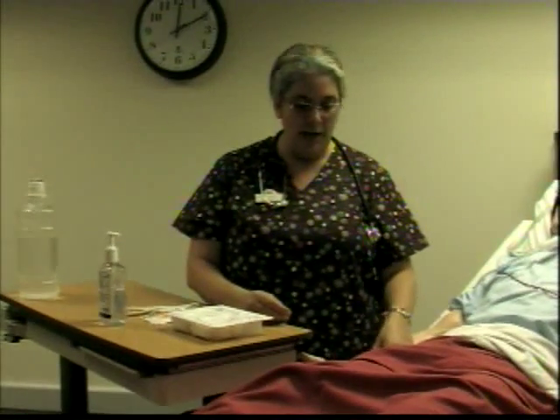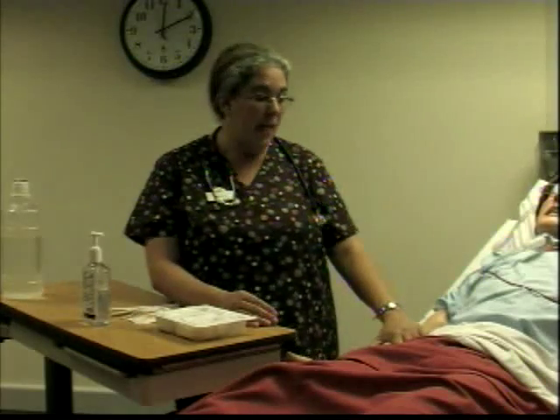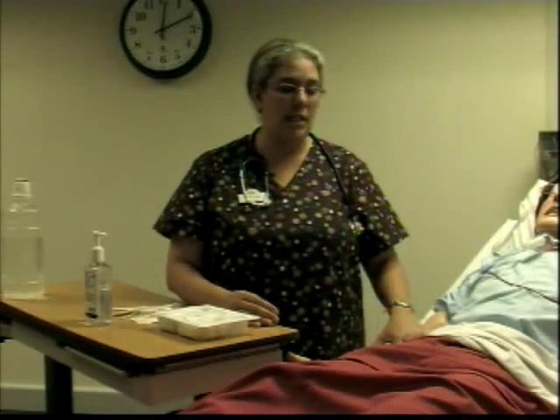So now we're going to demonstrate the trach care and how you clean and change the inner cannula. Like I mentioned before, at the beginning of your shift, most likely you're going to perform a trach suctioning and then you're going to do your trach care, and throughout the day you will be doing more trach suctioning. Or if this is a fresh trach, probably you will do trach care every 8 hours at the beginning just to make sure that everything is nice and clean and you do an assessment of the stoma. So the same assessment techniques and items that I mentioned before apply here.